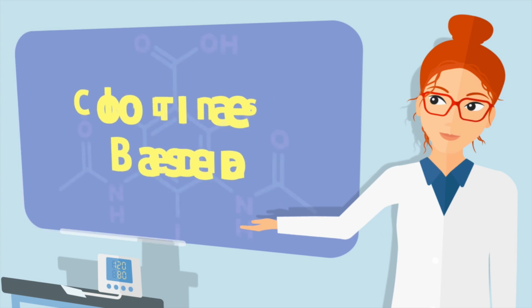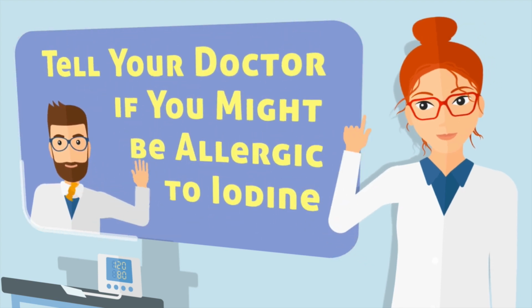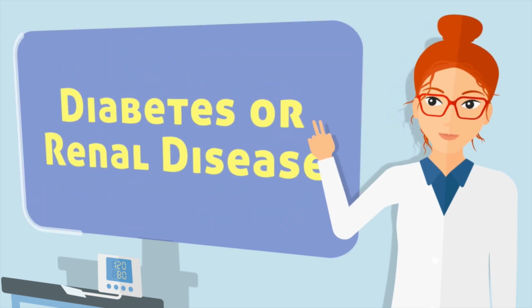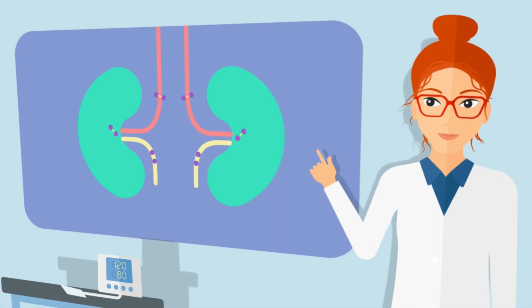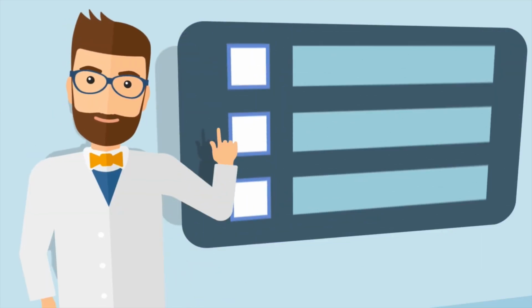Contrast media is iodine-based and in just a few patients can cause an allergic reaction. Please tell your doctor if you're allergic to contrast media or to iodine. Patients who have diabetes or renal disease require special care because the kidneys are involved in filtering iodine from the bloodstream. The examination usually takes between 10 minutes and half an hour.